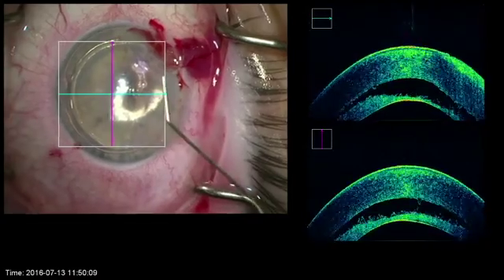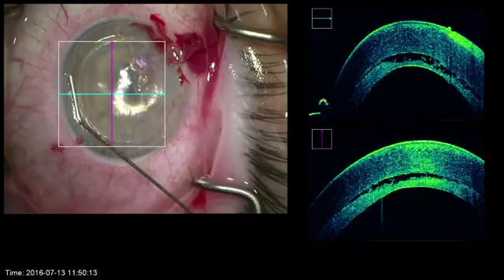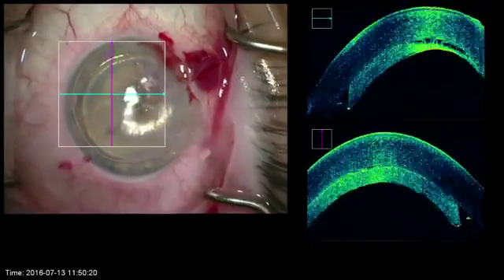Here is a repeat of that sequence and the continued sweeping in multiple directions that I performed following those first 2 strokes. Of note, even with substantial depression of the host cornea, the donor becomes more tightly attached rather than dislocating.